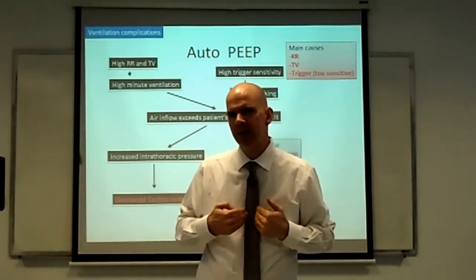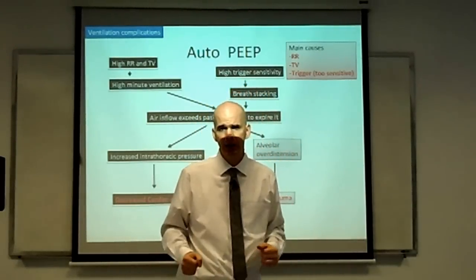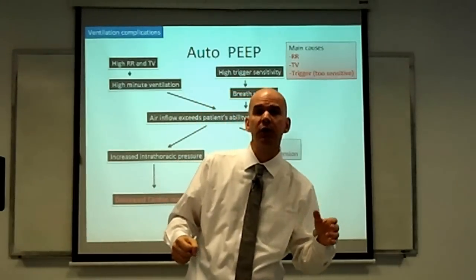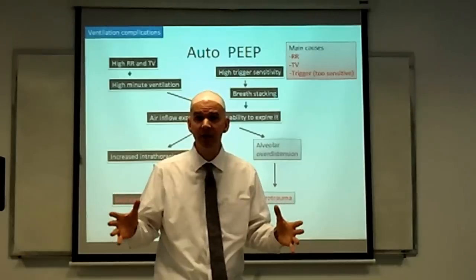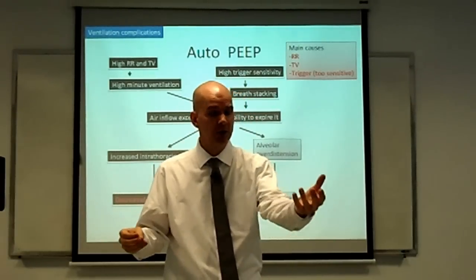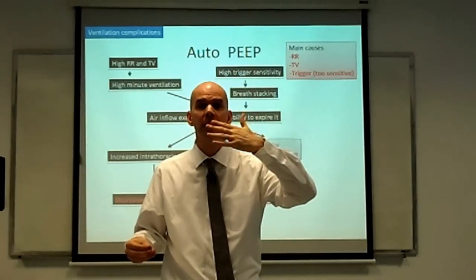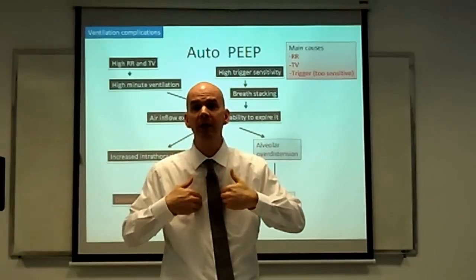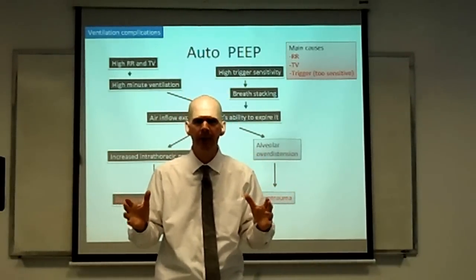And this air might be coming into my lungs at a faster rate than I'm capable of exhaling. Remember, as far as exhalation goes, this is purely based on the elasticity of my lungs. It's a purely passive process. It's not like the ventilator is sucking out air for me. It's only improving my inhalation. It's not doing anything for my exhalation. Exhalation is entirely up to me.